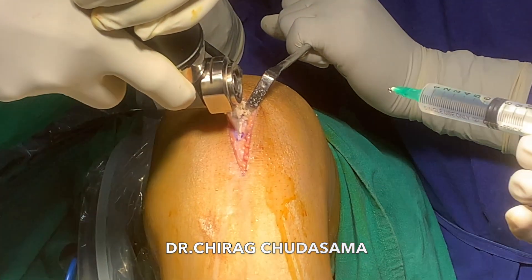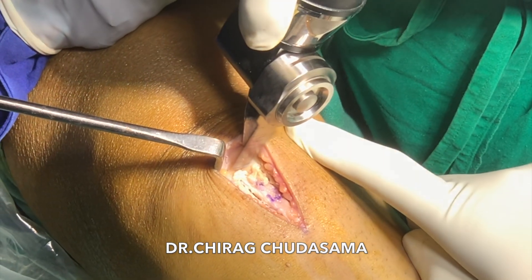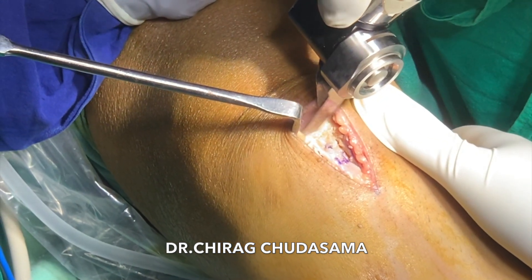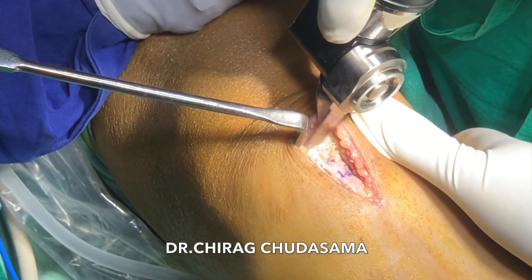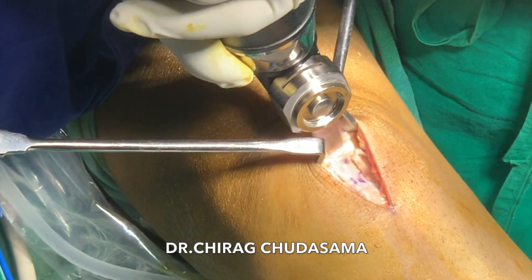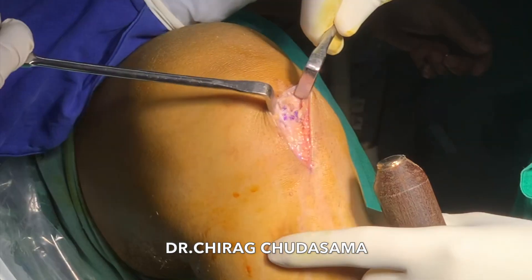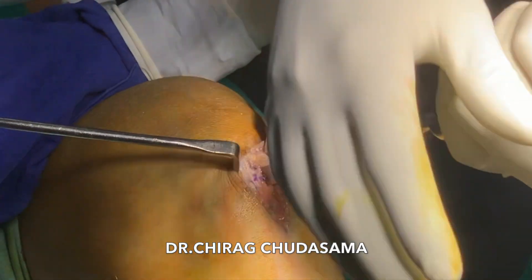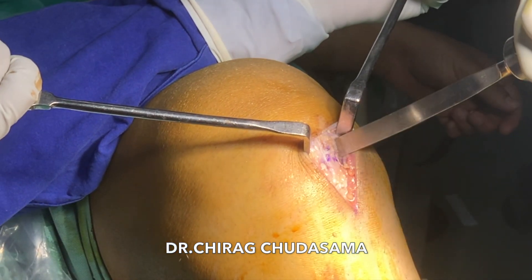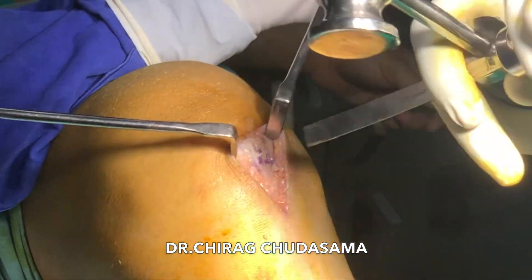I usually try to harvest in some form of trapezoidal shape, as it will be easier to separate the bone plug. After completing medial and lateral side harvest, we come to the proximal side. Only the angle of the saw is used to connect both the medial and lateral splits in the bone, because the saw will vibrate more and if you put it flat proximally it will create a cross-shaft bone stress riser. After using the saw, we will use the osteotome — a 15 mm wide osteotome which is used to complete the osteotomy.